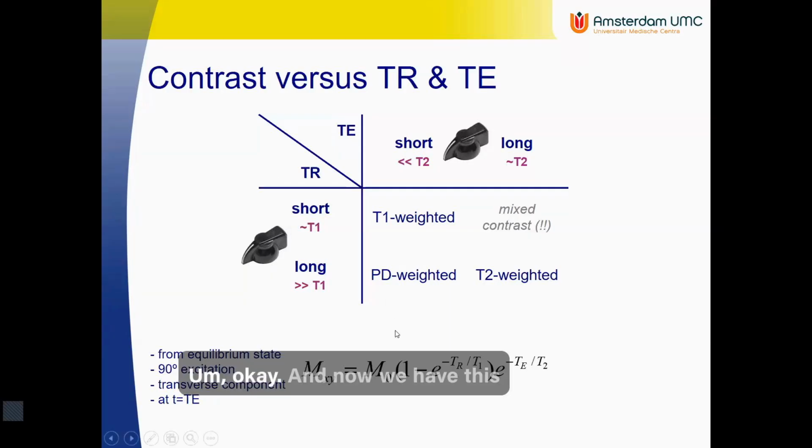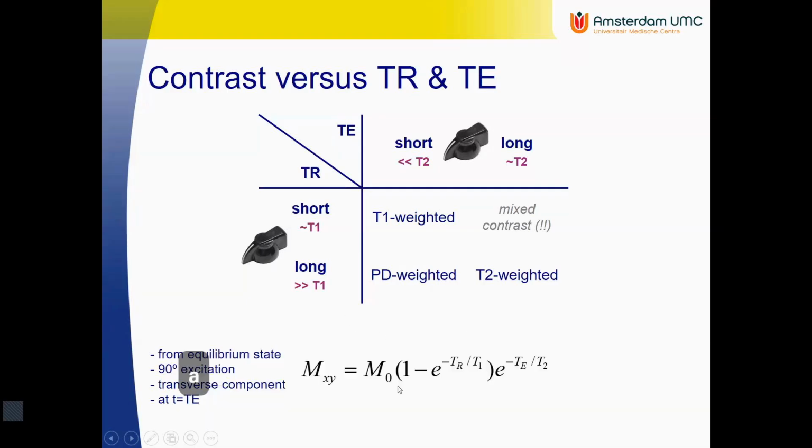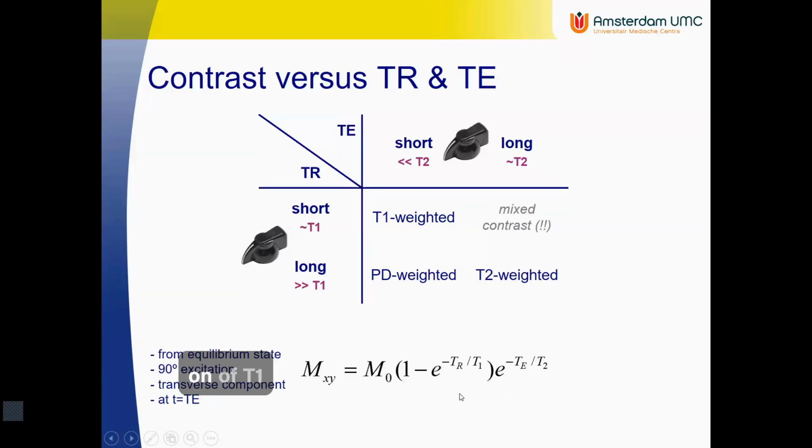Okay, and now we have this formula. It's a mathematical description, basically a multiplication of the formulas we saw earlier on: T1 relaxation and T2 relaxation.